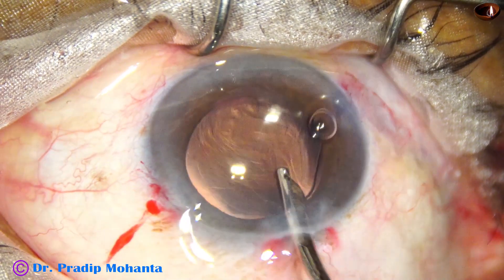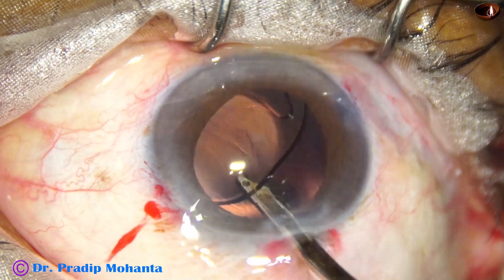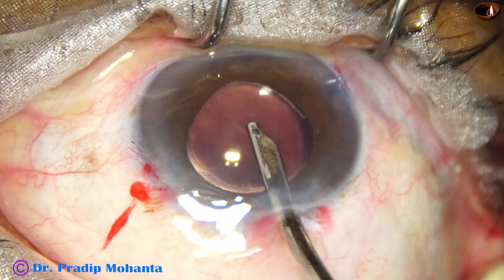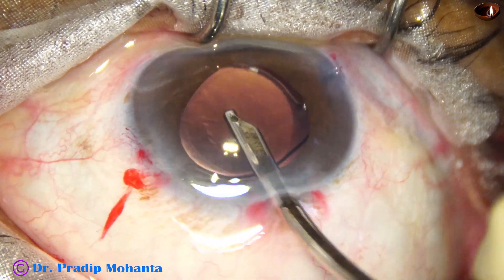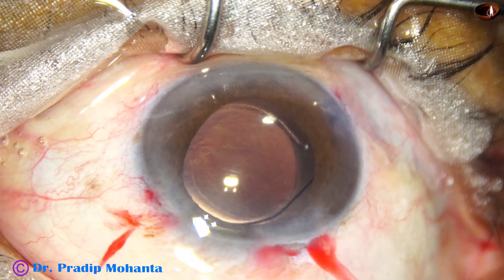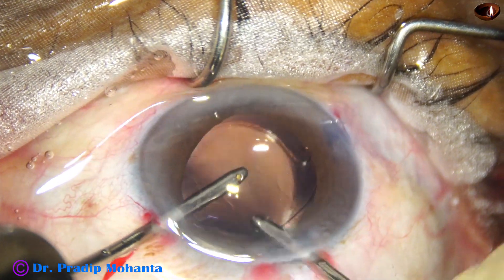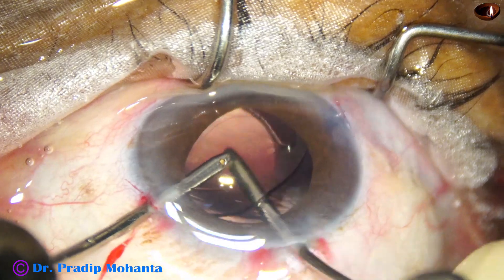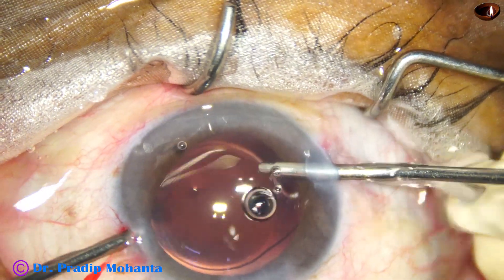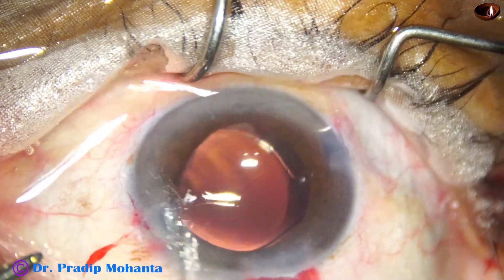Now viscoelastic cleaning is to be done nicely. First I use the Simcoe cannula — I go behind the intraocular lens, irrigate and aspirate the space between the intraocular lens and the posterior capsule, come anteriorly again and remove some more visco. Then I use the bimanual irrigation-aspiration. If you use sodium hyaluronate, it comes out as a mass, but with HPMC we have to spend some time to remove it. Nice cleaning is done.